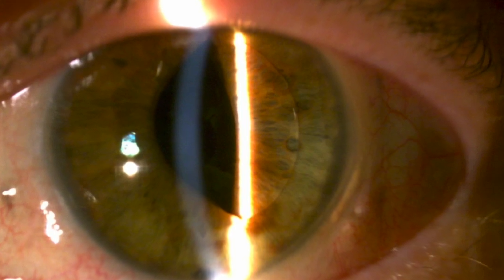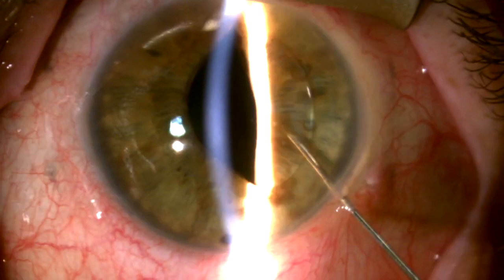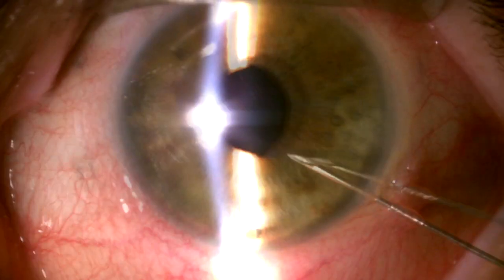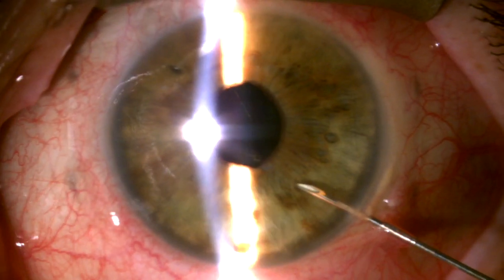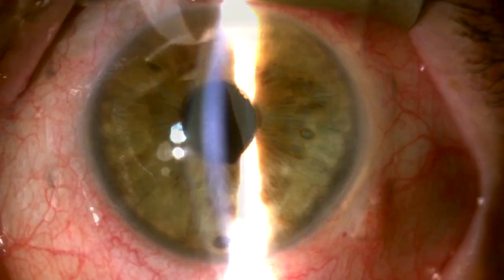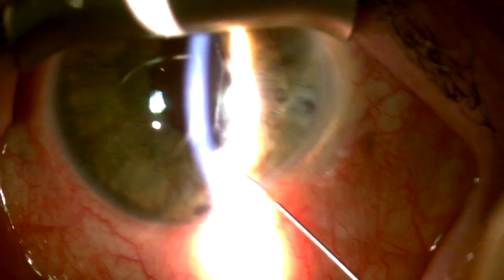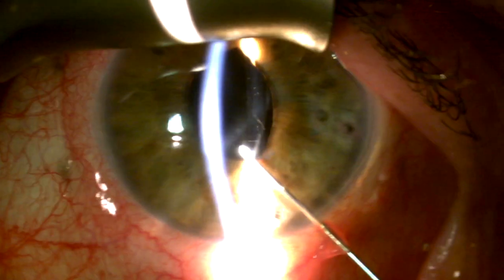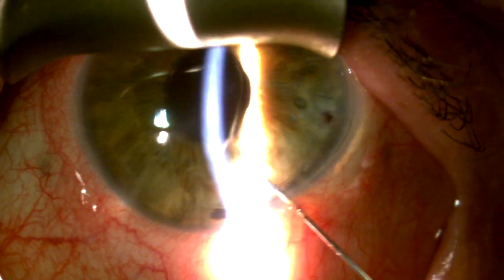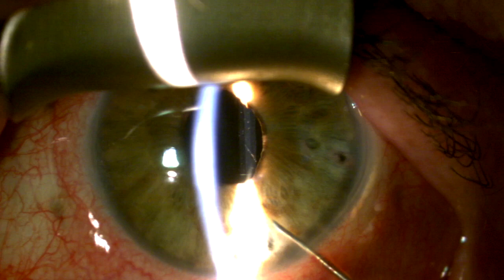This is a patient referred with recurrent iris capture of the optic of a sutured CZ70BD lens. At the slit lamp, I push the lens back behind the iris and place a peripheral iridotomy, but she comes back again and again with recurrent optic capture. This is despite having two patent iridotomies, and eventually I added a third iridotomy and still had recurrent optic capture despite the use of pilocarpine.